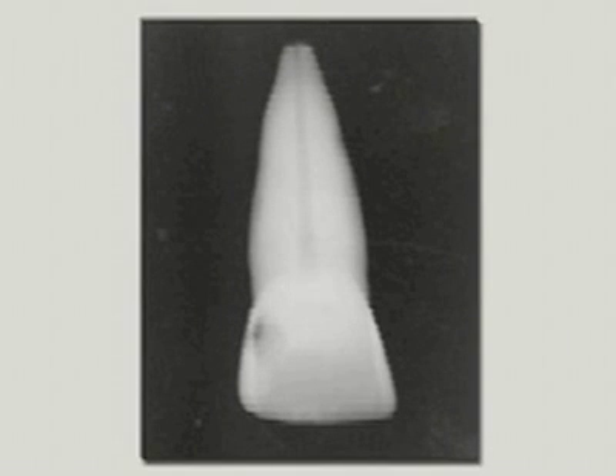Begin with an x-ray of the unprepared tooth. This start x-ray is important in making a diagnosis, as well as estimating the initial measurement of the canals. Study the radiograph as a blueprint to establish the size, shape, and location of the pulp canal and their relative positions.